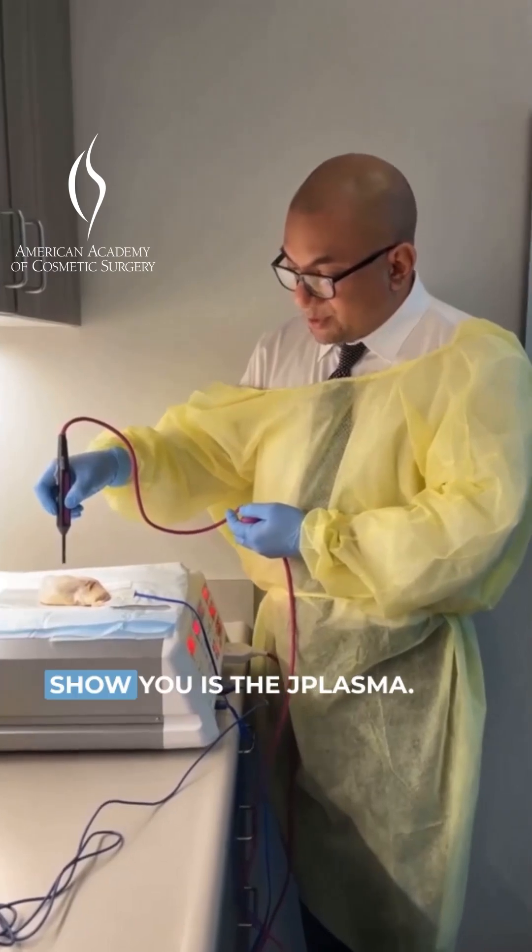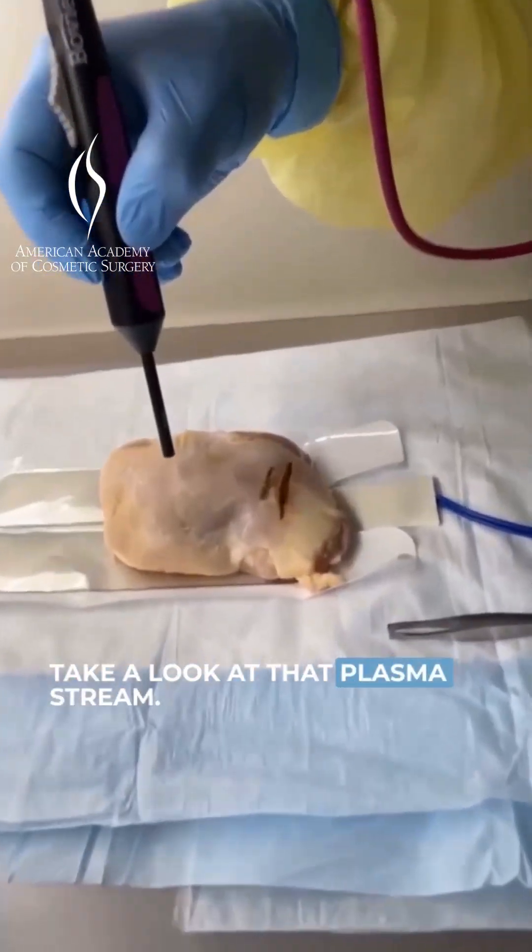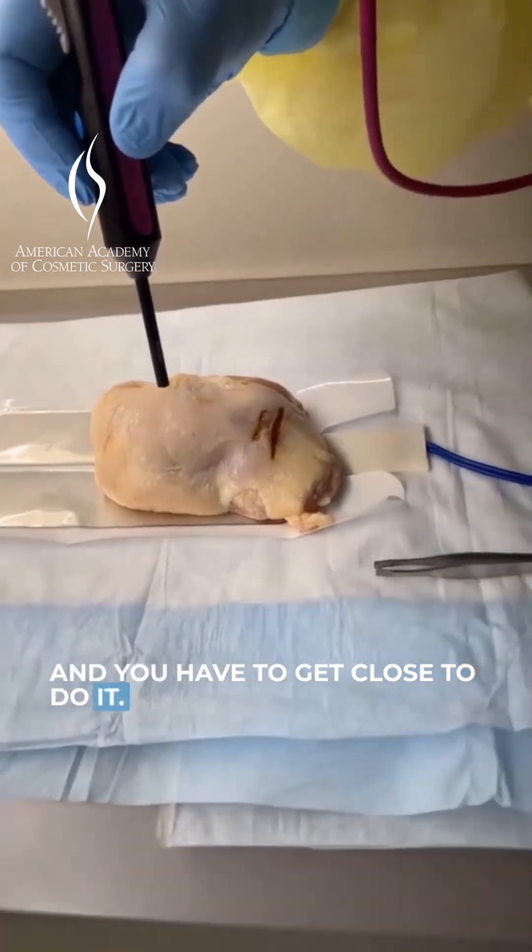The third thing I want to show you is the J-Plasma. Take a look at that plasma stream. You have to get close to do it, but it's very safe.